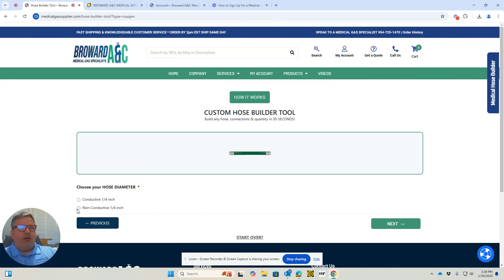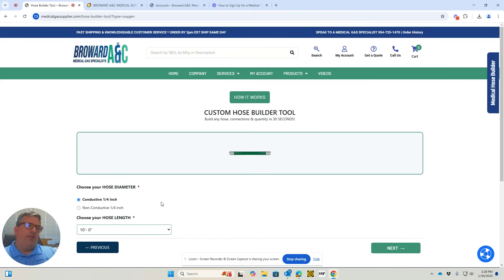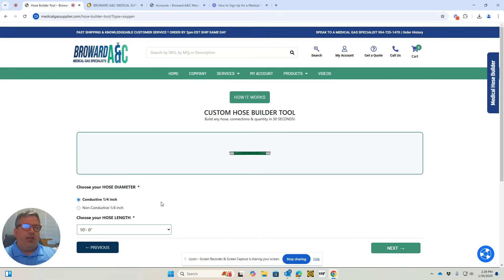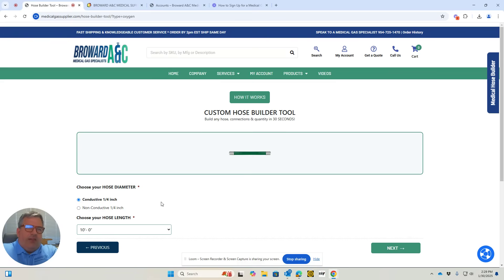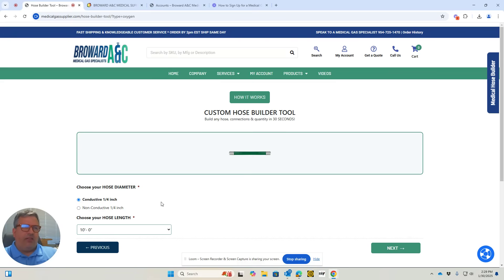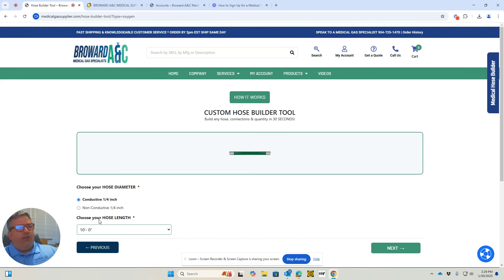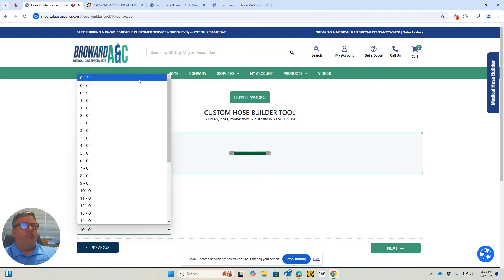We're going to select conductive. This is best for wet locations, such as an operating room or dental operatory, somewhere where there are fluids. If the hose comes in contact with fluids, it will dissipate the static electricity and be safe for the patient and people working with the patient. So we'll select conductive hose here.